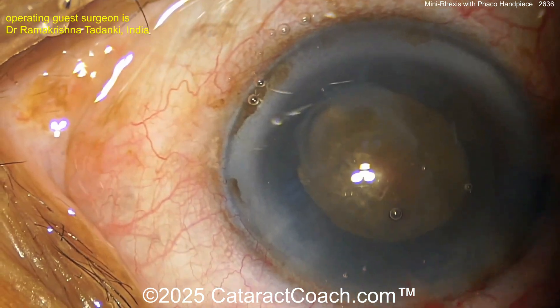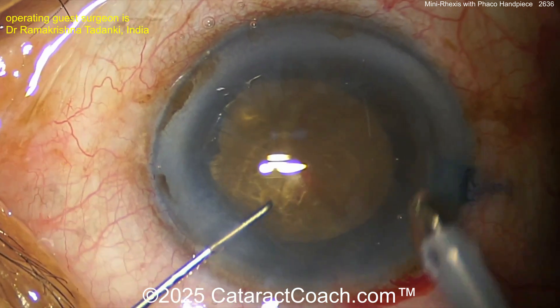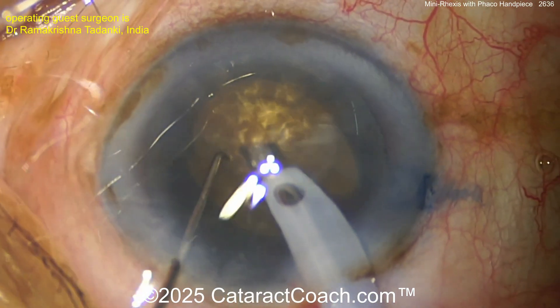You've decreased your risk of having an Argentine flag sign or capsule run-out dramatically. Recoat the endothelium with viscoelastic — I like that idea. Here comes the phaco probe; this is a dense cataract. Let's see the technique.